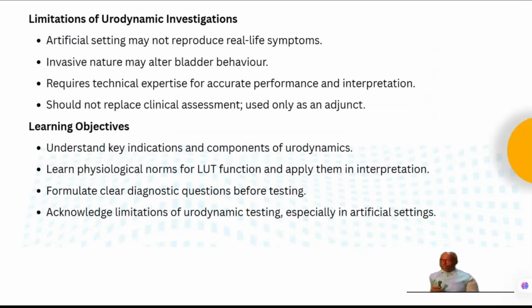What are the limitations of urodynamic investigations? The artificial setting may not reproduce real-life symptoms. The invasive nature may alter bladder behavior, it requires technical expertise for accurate performance and interpretation, and it should not replace clinical assessment and should be used only as an adjunct. Performing urodynamics should not replace the clinical assessment. The clinical assessment, the history taking, the examination of the patient, that is a must. And urodynamic testing will be an adjunct to your clinical examination to answer the question.